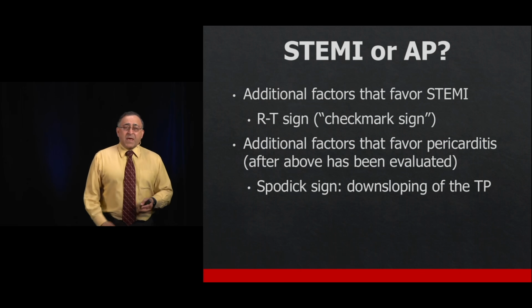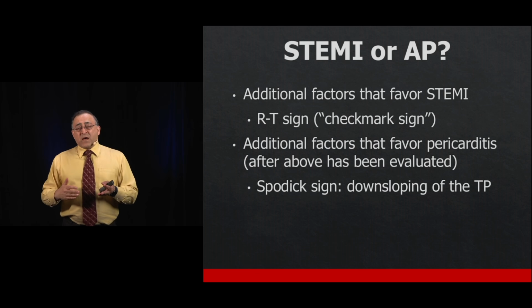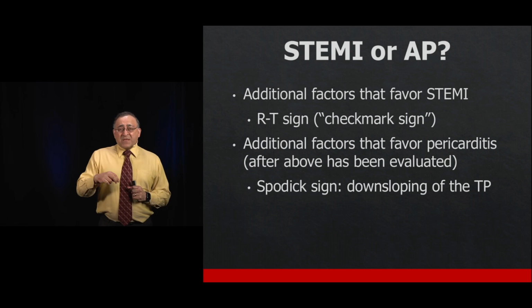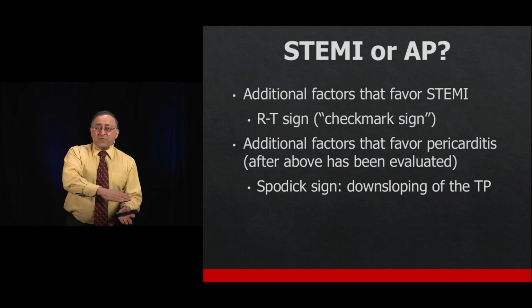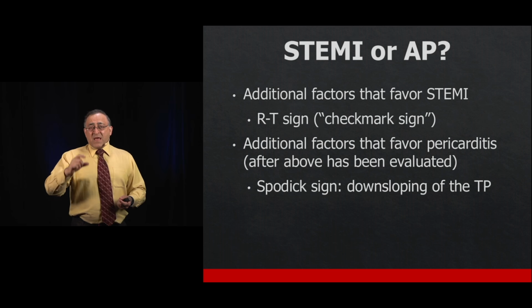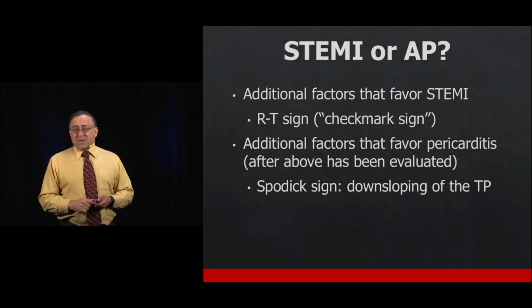All right? Okay, so we have our algorithm for trying to figure out, when you're looking at the EKG, how to tell the difference between STEMI versus pericarditis. I'm going to give you 2 additional things to think about. These are things that I recommend you do at the very bottom of your algorithm. So go through everything that we've talked about first, and if those don't give you an answer, these are a couple of additional things that might be helpful.